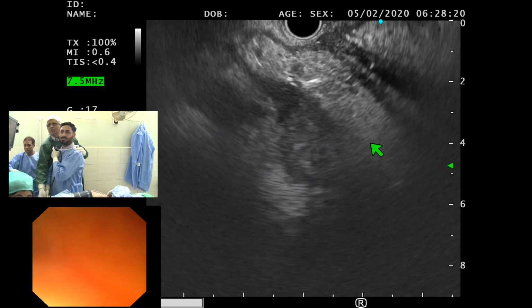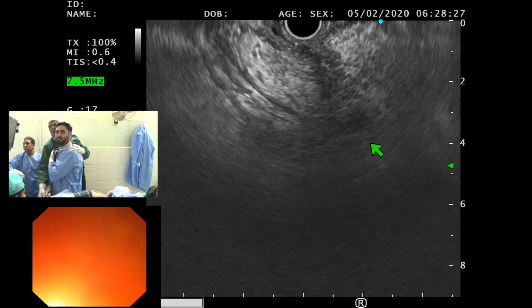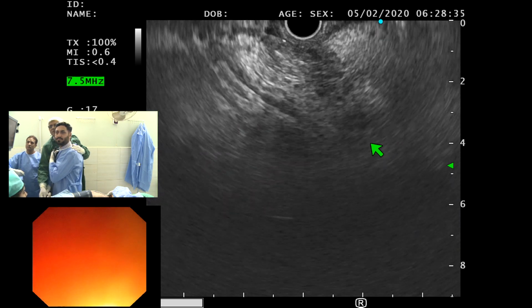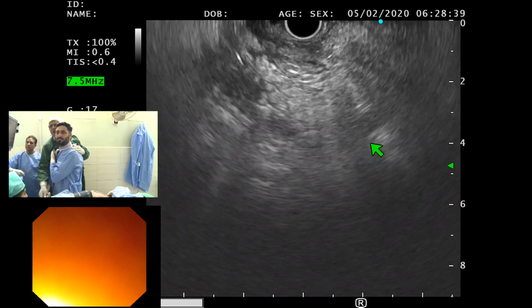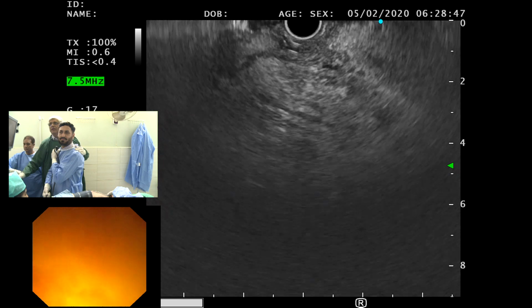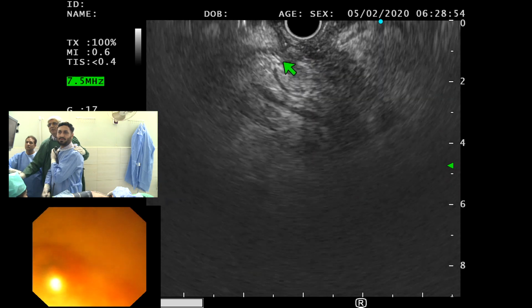Okay. So we'll now keep doing rotation. Yeah. So now you've got the stent there. Can you see the stent? Yes, sir. Okay, good. So you can pull back, let go of your big wheel a little bit, tip down. That's it. So now if you go anti-clock a little bit, you can see the stent, and you can see this area there, right? And the PD will be visible in a second, but this is the area you're talking about, and I'm not too sure.